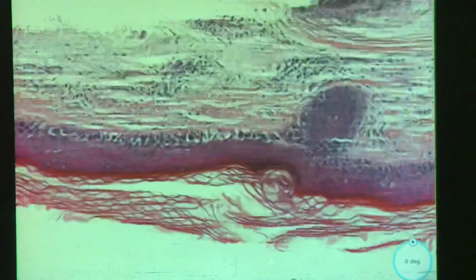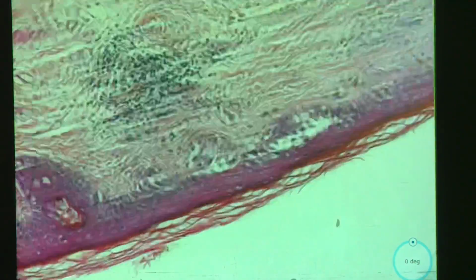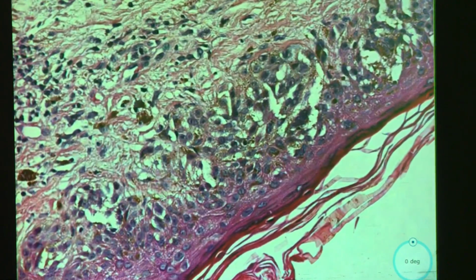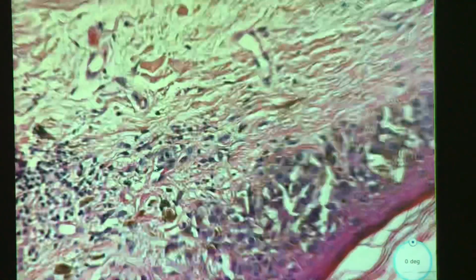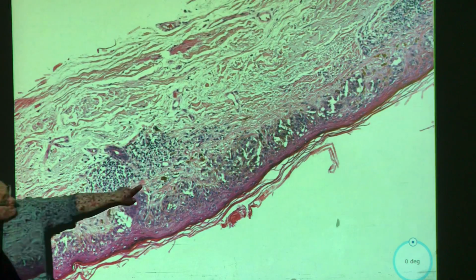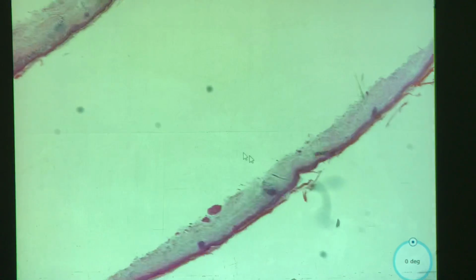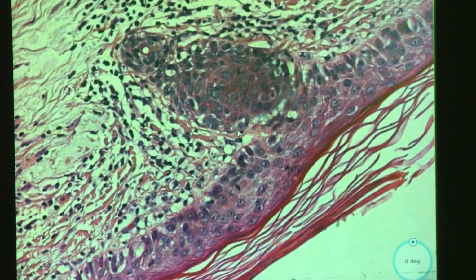Oh. Okay, I don't know. I think it's still part of the lesion. Let's see. Going back. I think it is. It's coming through and invading, maybe. I think you're seeing the melanophages. These are melanophages. So remember, they're big and round, but half the battle is spotting all these things.